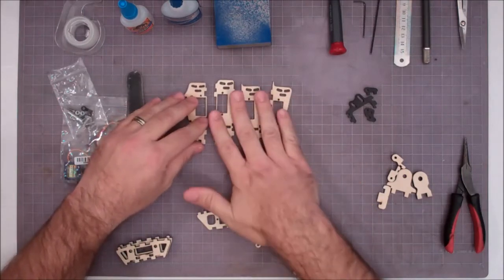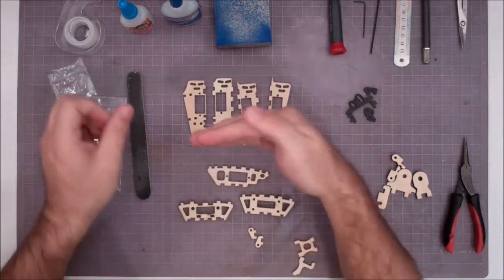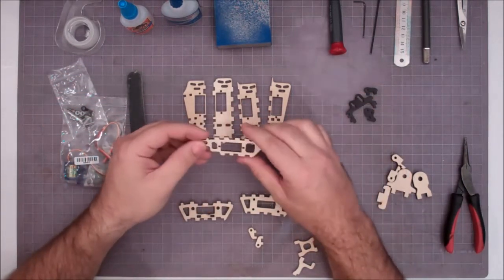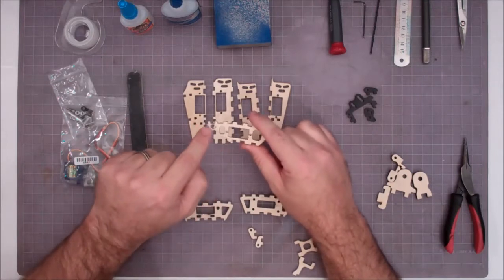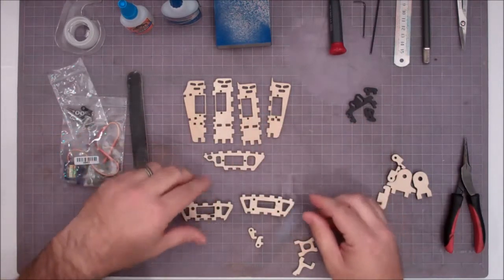So next is, those are the 4 plates. Now, these plates are your verticals on the palm. So this plate comes first. It's going to go in the first set of slots. And the side with the notches in the hole, that is the thumb side. So we can lay that plate there to call it the thumb side.